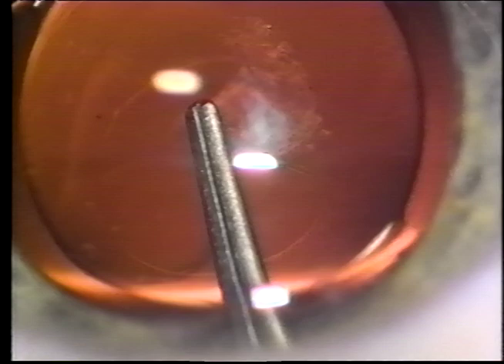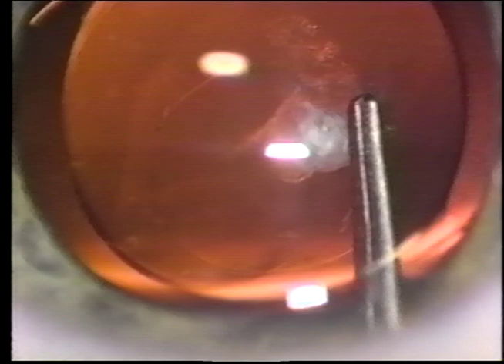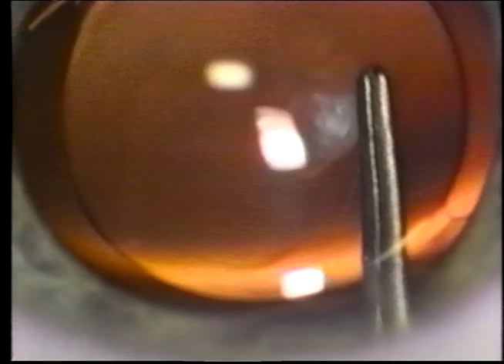In this case, PCCC is being employed for the removal of a thickened fibrotic posterior capsule plaque. In these cases, the PCCC is made as a controlled circle that encompasses the central opacity and results in a posterior capsule opening that resists extension to the equator. I first used this technique in 1987 for the removal of a dense posterior plaque in a seven-year-old male who had developed a secondary cataract after radiation for rhabdomyosarcoma.